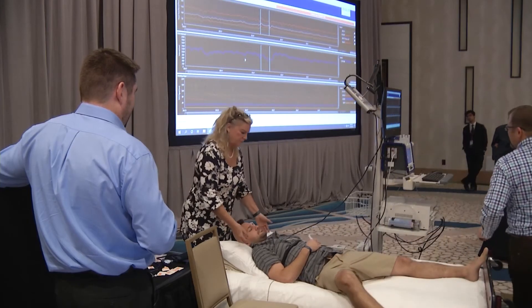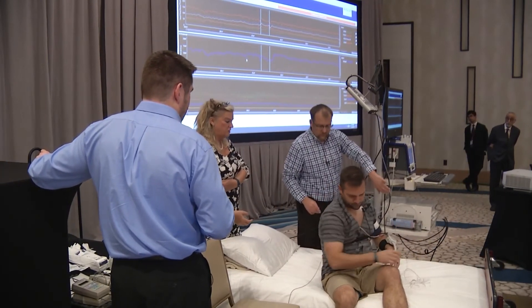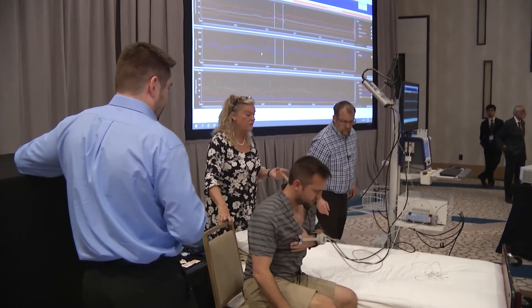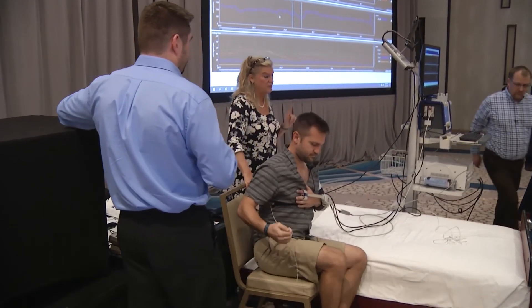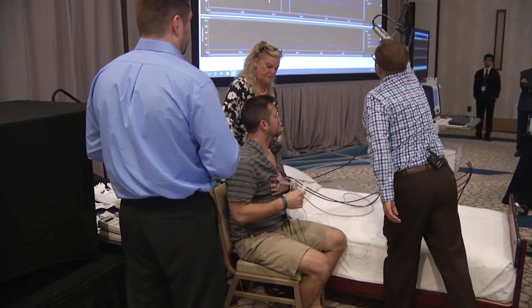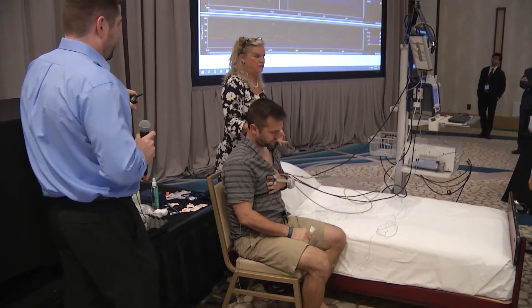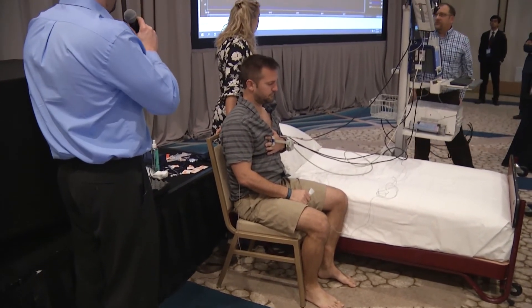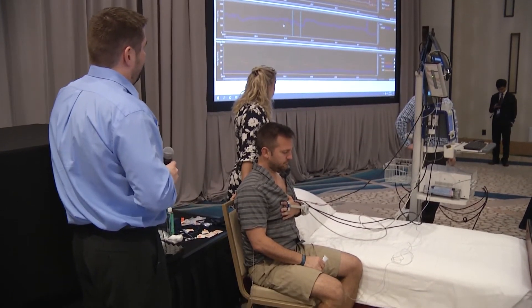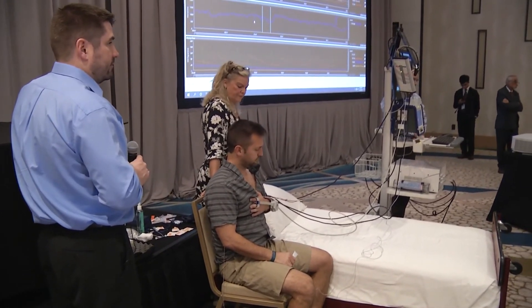Sure, let's try that sitting position. We're going to have him put his arm across his chest. We've even done these standing, so you need to be careful because the patient is awake. Feet flat, make sure legs aren't crossed. Again, you want to wait until there's a nice baseline and then we'll give it a try. Normally we would wait three minutes before doing anything to make sure everything stabilizes.